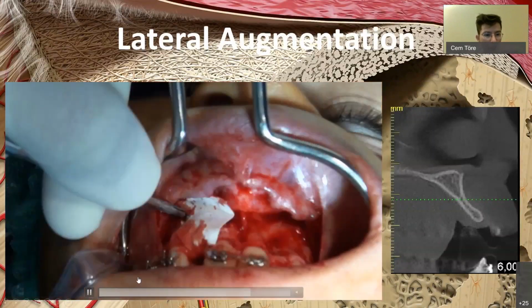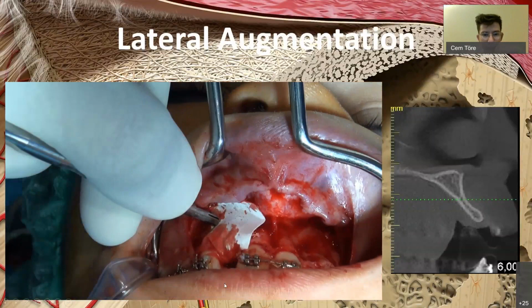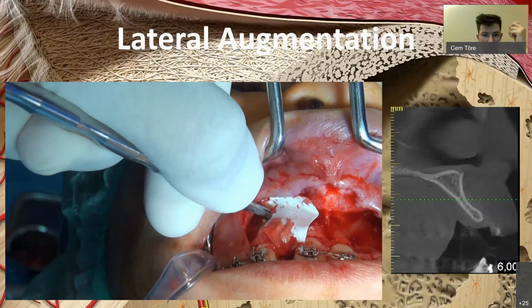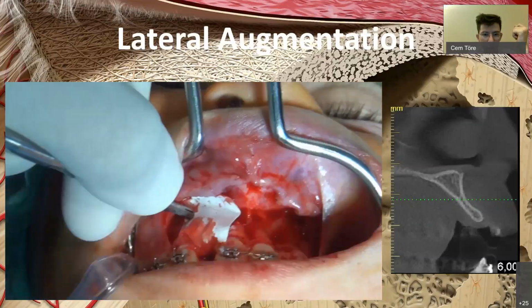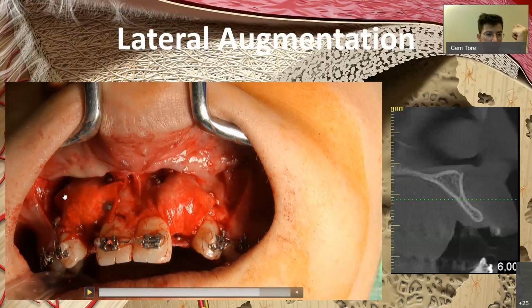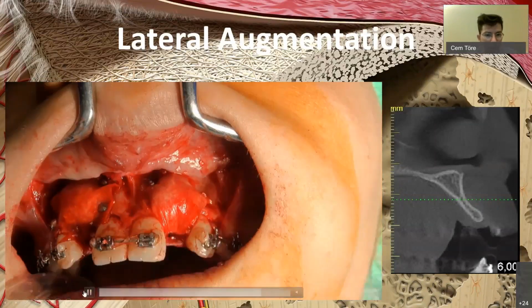Now we will fold the membrane that was hanging from here over the graft we have placed, and now we are placing pins to immobilize the graft and the membrane. It is essential to use a sufficient number of pins. As we can see, we have placed pins here to close this area. We have left this area open and this area open to do this trick you will see now.